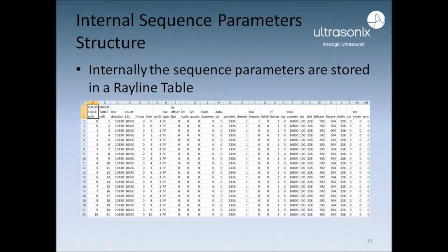Going back to our simple example from previous slides, when we are doing B-mode imaging with 128 scan lines, our ray line table may consist of 128 rows which constitute the 128 scan lines in the sequence. The TXID and RxIDs for these lines will be 0 to 127, corresponding to the shoots and receives that we put earlier in our shoot table and focus table.